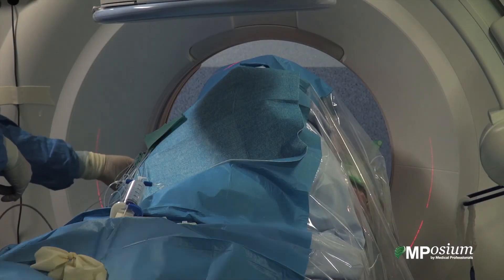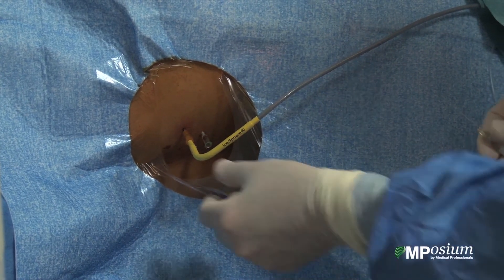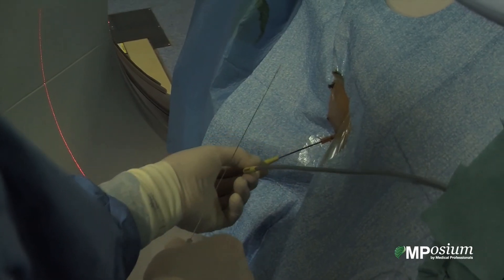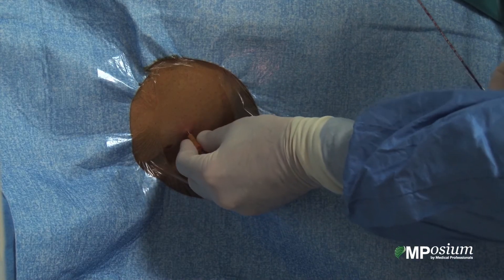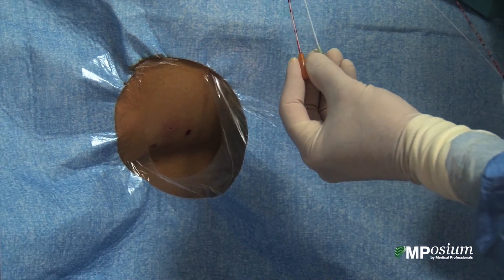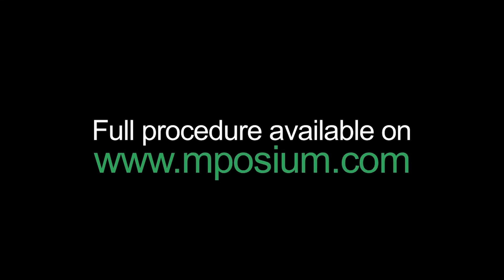I'm now pulling out the needle I used for aero dissection. I'm pulling out the cryoprobe I used for treatment, and I'm retrieving the two guiding cannulas I used for the cryoprobe and the 22 gauge needle. Thank you very much.